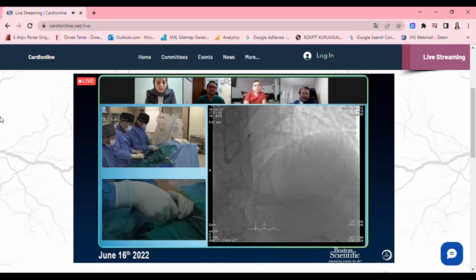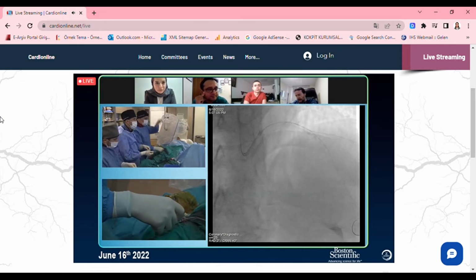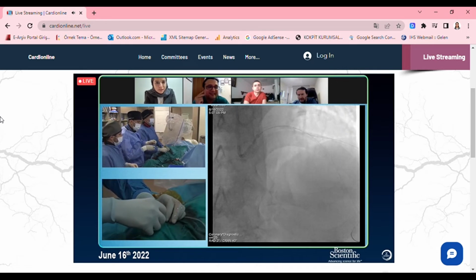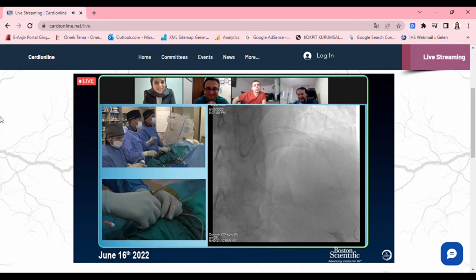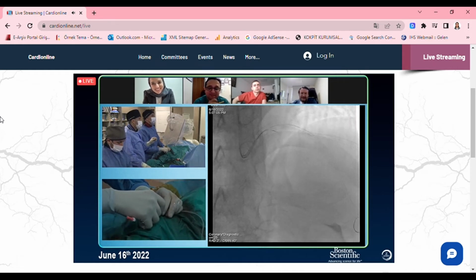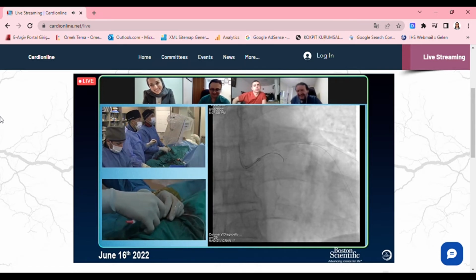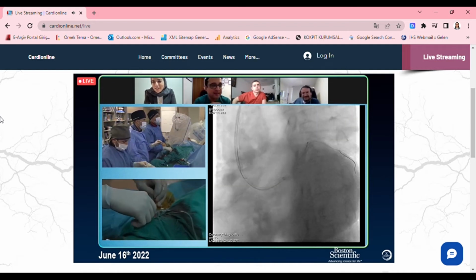In an RCA, would you go with pacemaker or aminophylline nowadays? The question goes to who? If you're doing a rotational atherectomy in an RCA. Goes to you. When you don't know the answer, who are you asking? She's asking everyone. He's asking you. She's asking me.